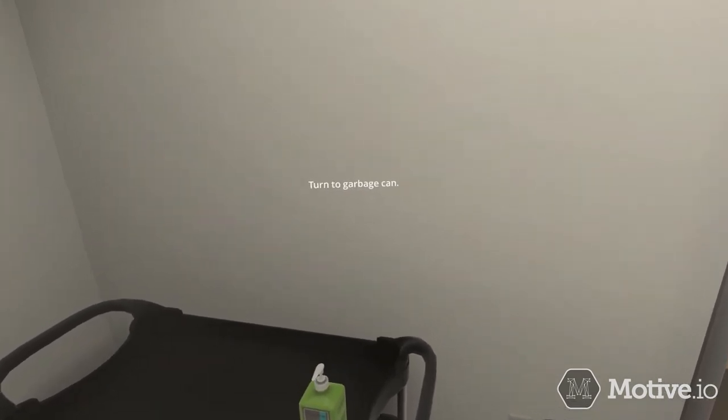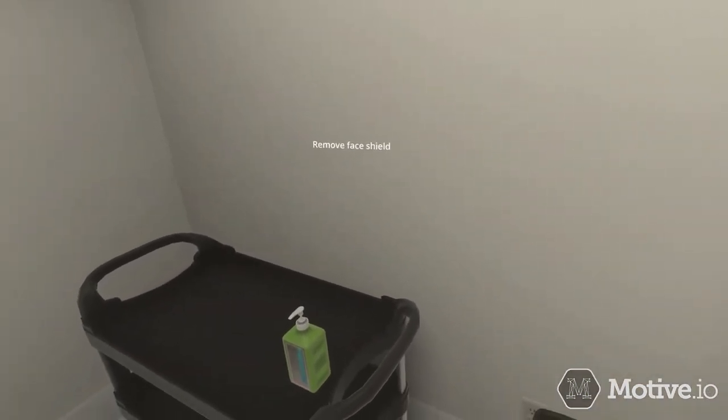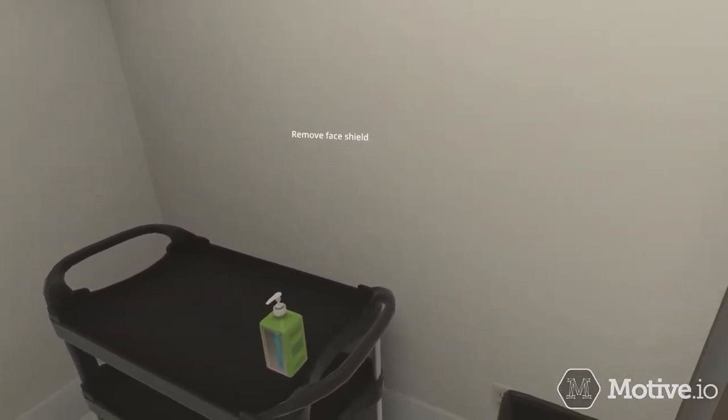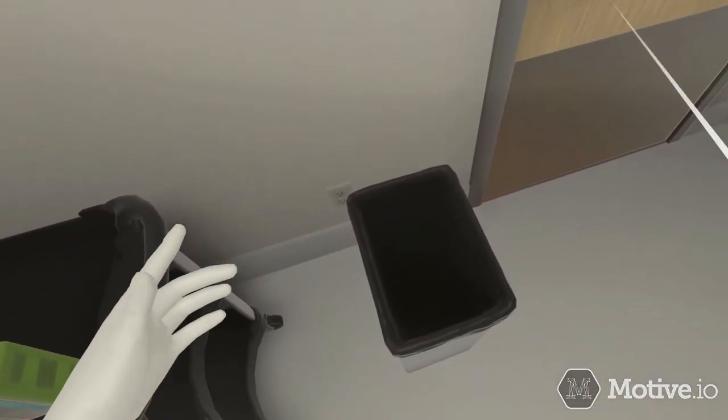Remove your face shield next. Do not touch the front of the face shield. Bend forward, grasp the strap toward the back, pull it over your head, and discard in the trash bin.